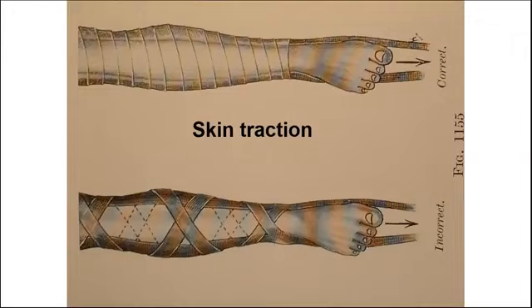or simply you can use this for temporary immobilization of shaft femur fractures, distal femur fractures, even proximal femur fractures, while you are waiting to do definitive treatment. Very important to control pain, to stabilize the patient while you are planning final treatment of respective fractures where it's indicated. This should be very universal. Almost every facility should be able to access skin traction kits.